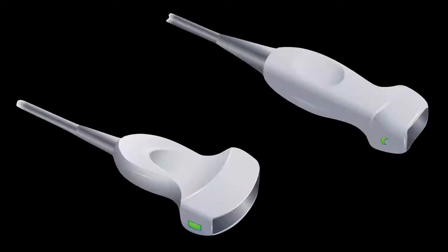The probes that can be used are the curved array or the phased array, either of which can be done on abdominal preset. The curved array will have a larger interface and a higher frequency compared to the phased array.